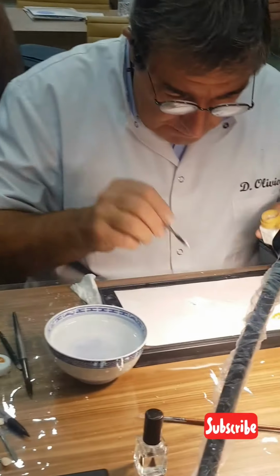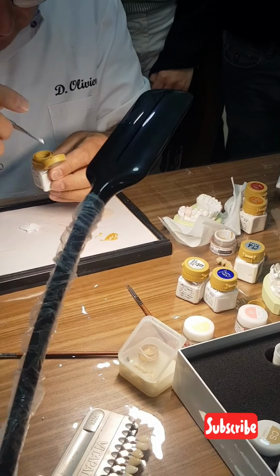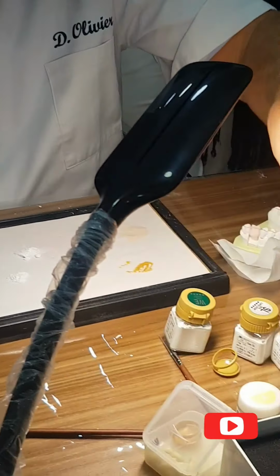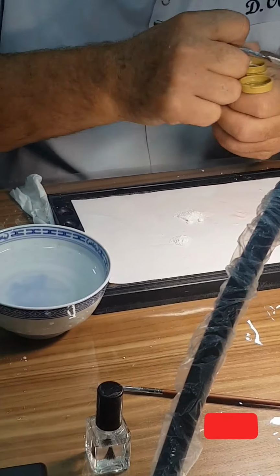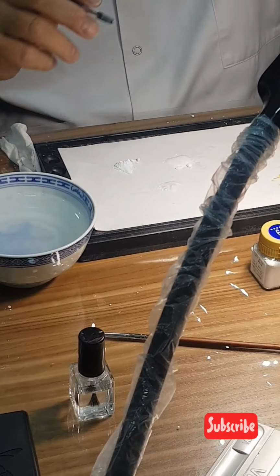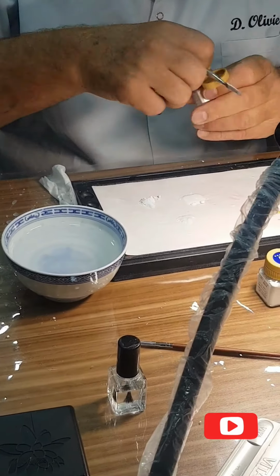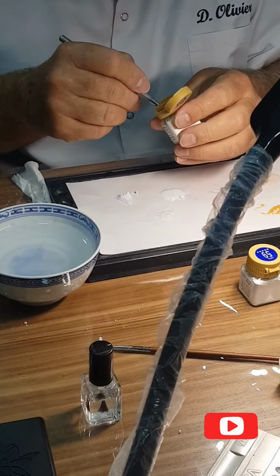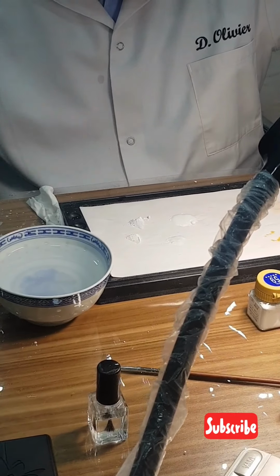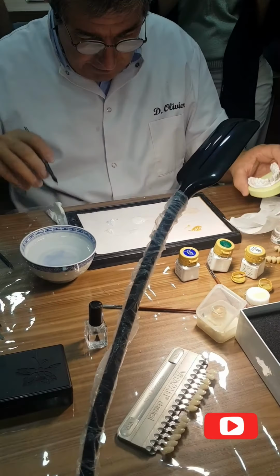Superlucent, white for the crest. We have decided to make a whitish crest. 59, very easy, normal. And here, what I need, cervical, I will explain why. CT, cervical translucent. It's a beautiful material. And look, very easy.